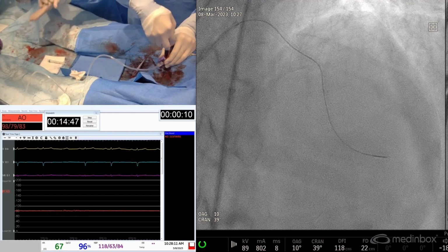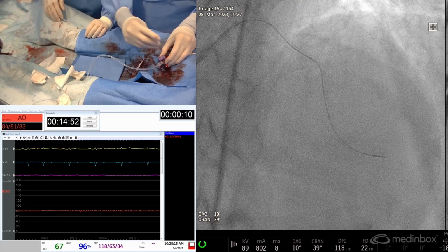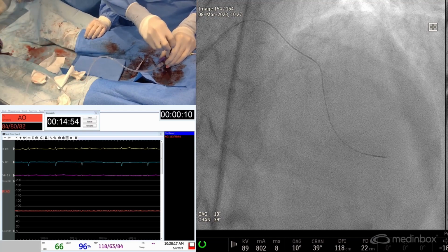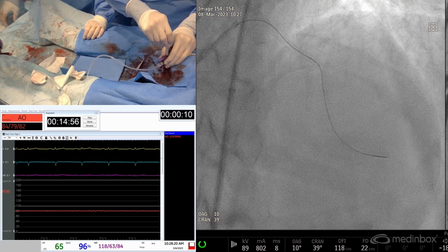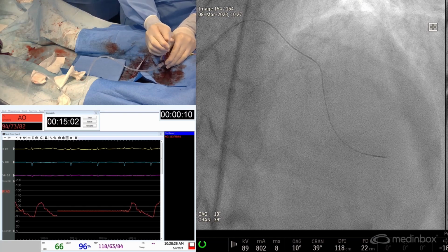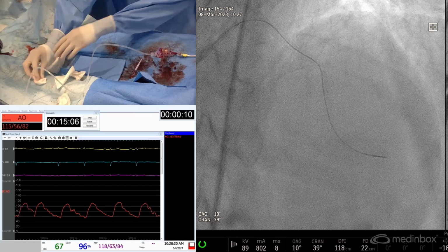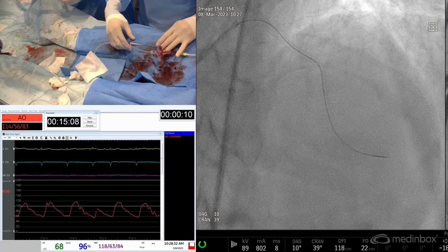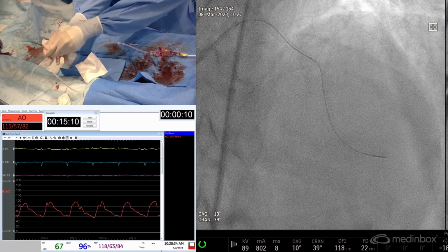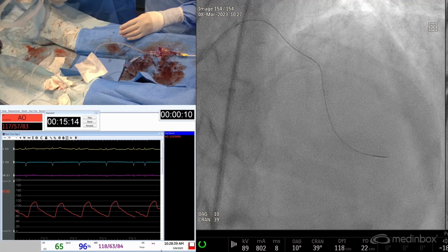So there's a lot of questioning around calcium modifying techniques and strategies. As you all know, the plain old balloon is just no longer enough. There are also the scoring balloons or the Wolverine balloons that are quite interesting as a first line after POBA.